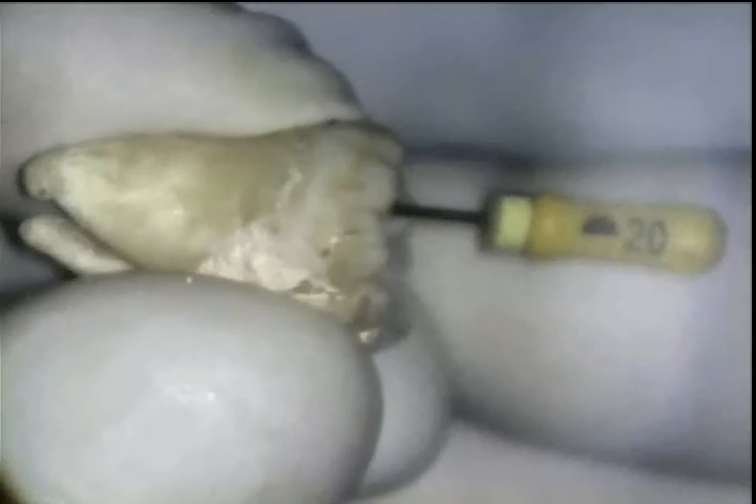Here you can see me doing the same thing with the number 10 reamer. I follow this with the number 15 relief reamer. Next is the 20 reamer, pre-bent and used in the same manner. Please note we have managed to take the canal to a 20 without any visual signs of distortion.